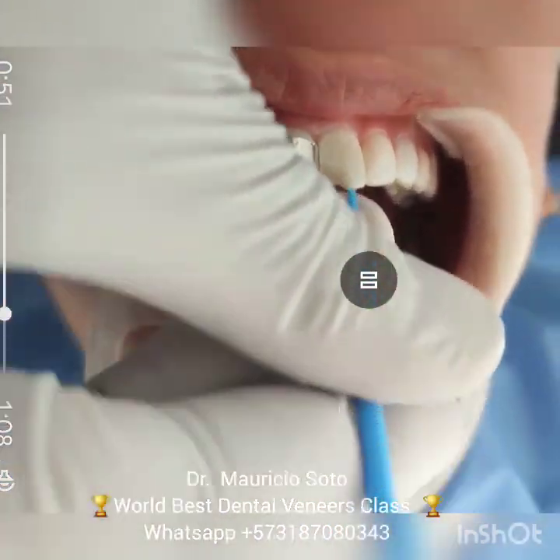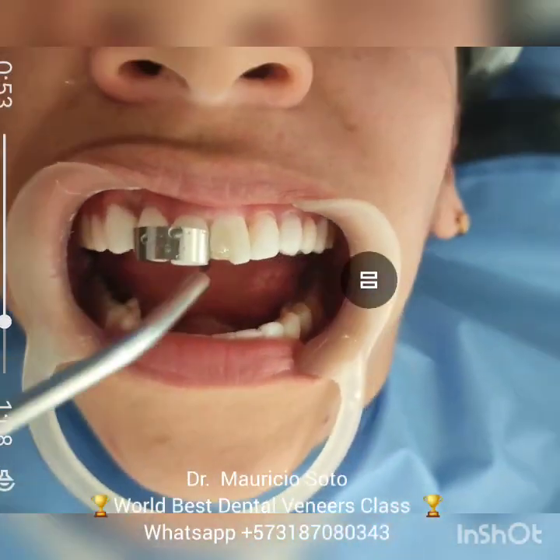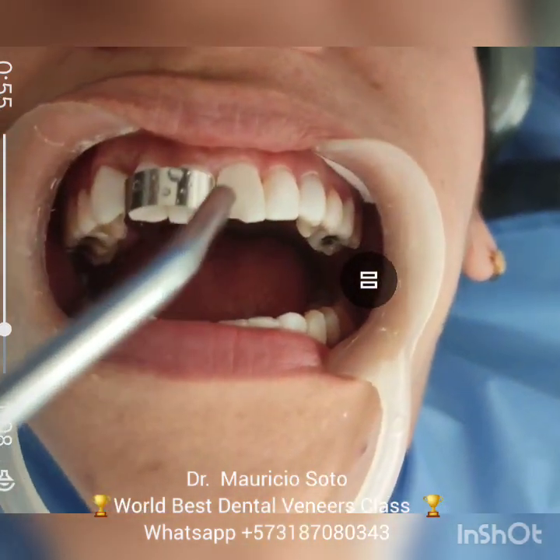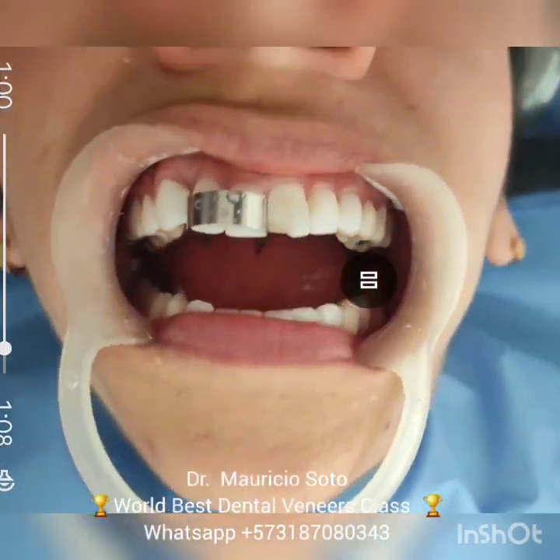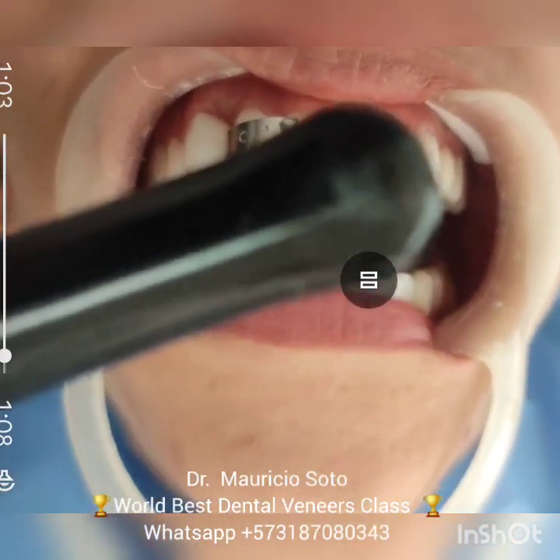After the etching, we apply a layer of bonding and a little air. We then cure the bonding with the curing light for 40 seconds.